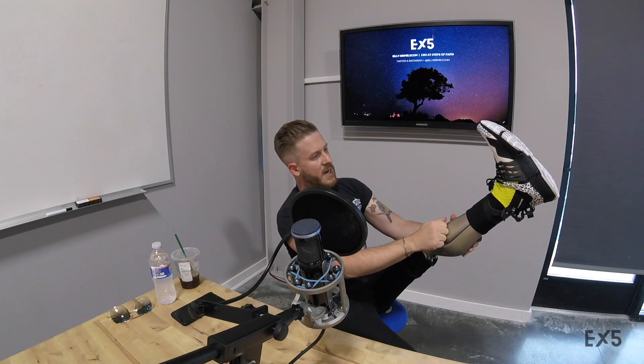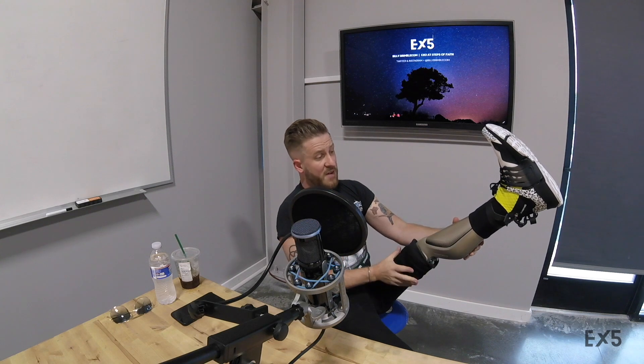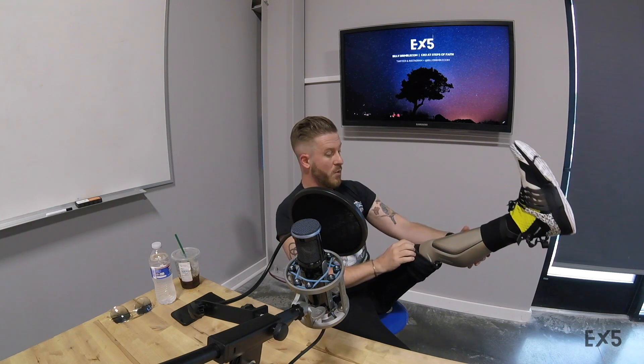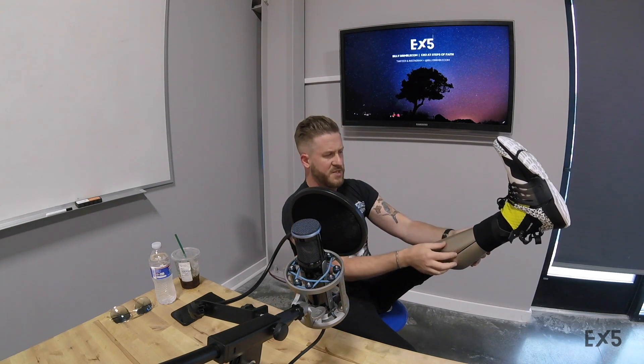So here's the cover - this does a couple things. It can be cosmetic and it kind of fills the pant leg out. I wear shorts in the summer so I'm not too worried about that, but for me it works as a bumper. This is all beat up - I'm on my knees all the time with my kids.